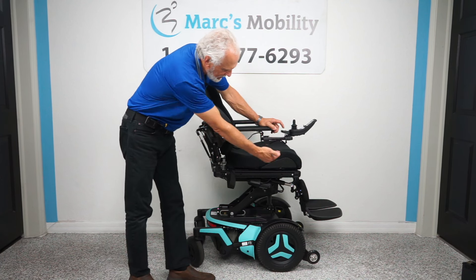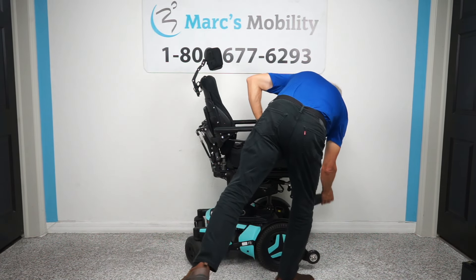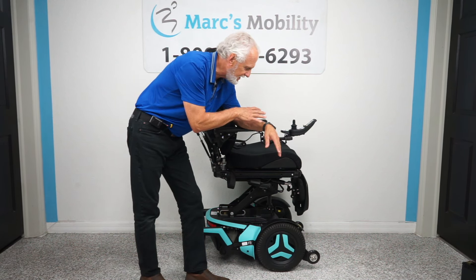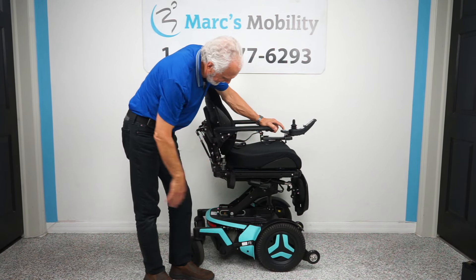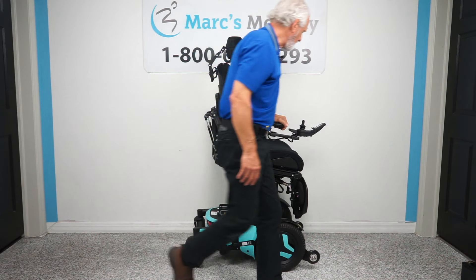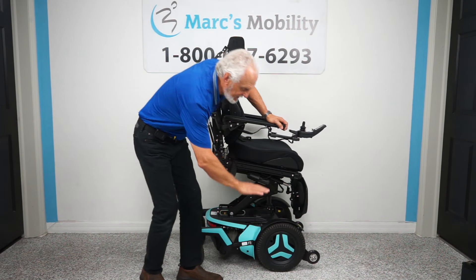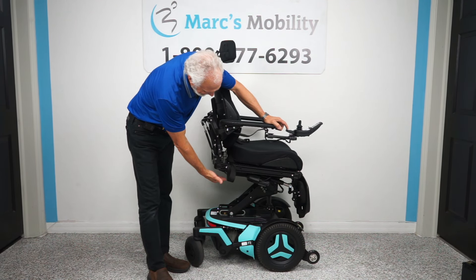I'm going to bring the legs all the way in and raise these foot plates up. Some of you are still able to get out of your chair to pivot or transfer to another seating system, and this just makes it easier to get off. I said it had the anterior tilt — if I push the second button down, watch the back: the whole seat tilts forward. This is called the anterior tilt. So if you're in your chair trying to get out, this helps you get up without having to push yourself from a fully reclined position.